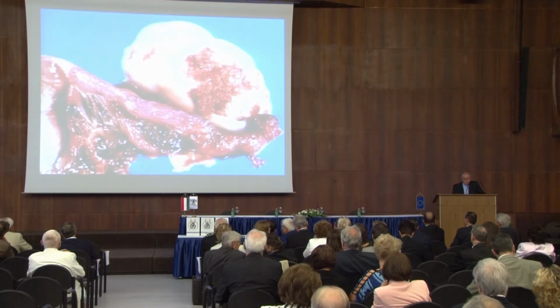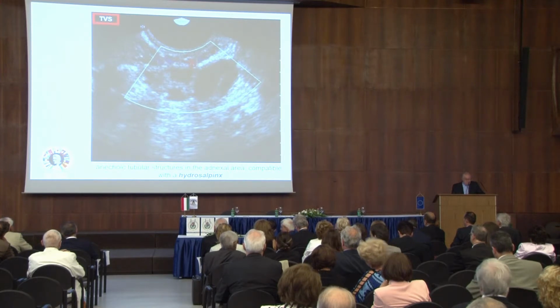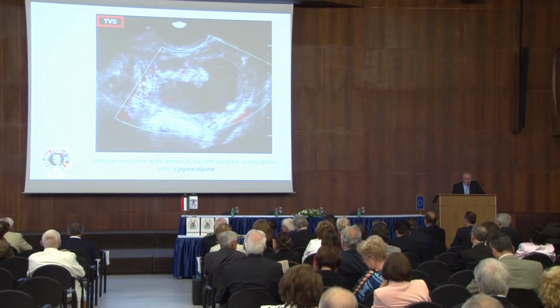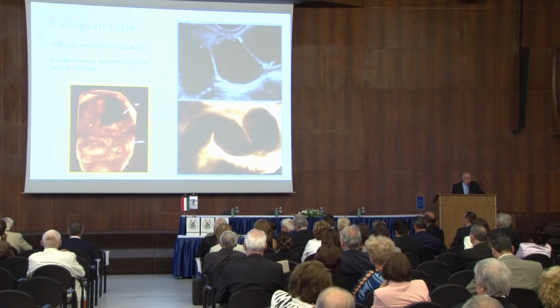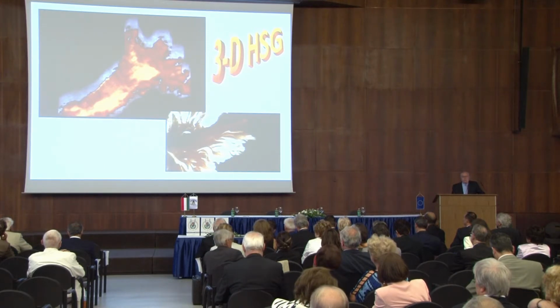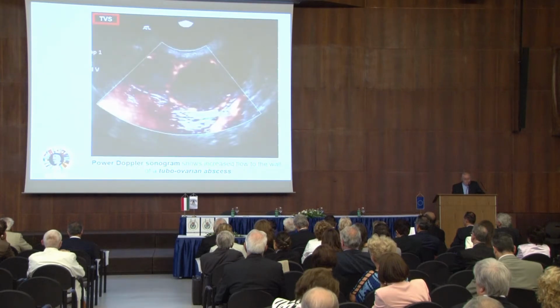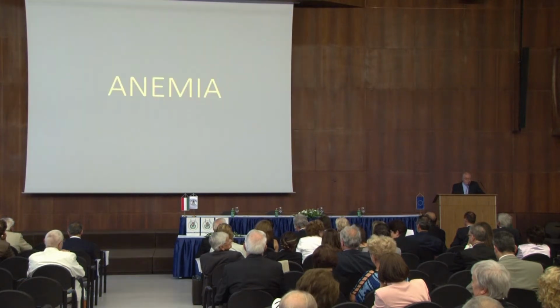But in a picture on which we see the distal part of the fallopian tube, you don't need sophisticated 3D to detect it. This is a tubular structure in hydrosalpinx with a conventional method. This is with debris in the left adnexa, and this is pyosalpinx detected non-invasively. Fallopian tubes are difficult to detect by 2D, but easy when we have free fluid in the pelvis or tube, so inside or outside the tube. So significant advances have happened in visualization of the full length of the fallopian tube, with several examples showing normal, abnormal, patent, non-patent fallopian tube, and a power Doppler sonogram showing increased flow to the wall of a tubo-ovarian abscess. Again, color Doppler, in particular 3D power Doppler, is helping.